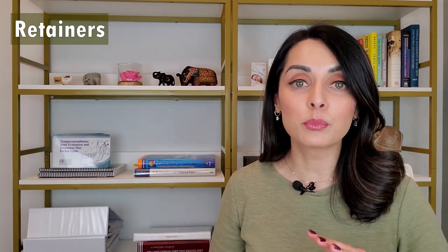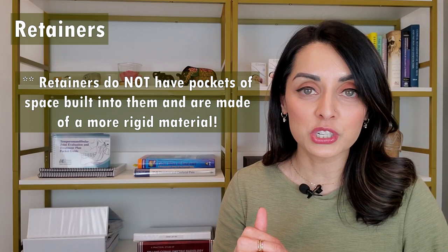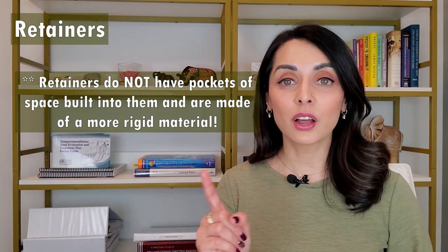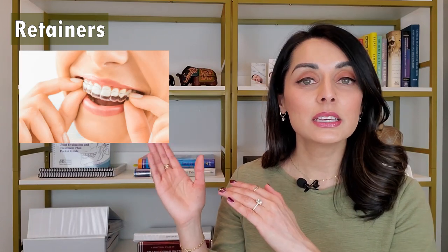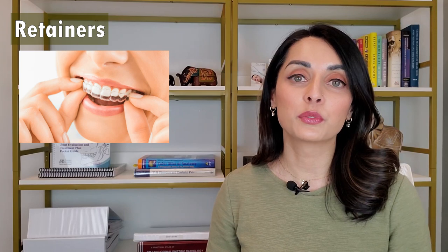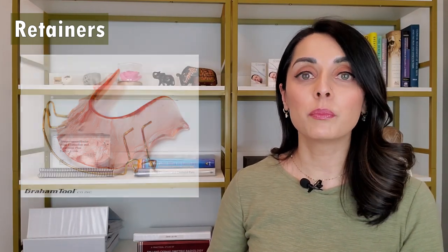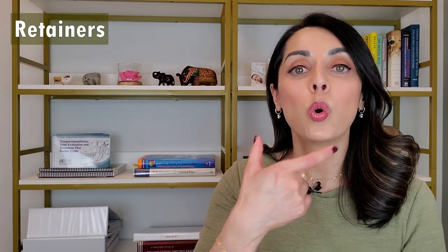How are retainers different from bleaching trays? They are quite different. They might look similar because some retainers can be clear and look like a bleaching tray, but they are quite different. They still fit well over the teeth, but there's no pockets of space to allow for whitening agent, and they fit pretty rigidly against the teeth. The primary function of a retainer is to hold the teeth in place — not to allow room for whitening agent like a bleaching tray. If the retainer is in fact clear, it often looks like this — this is an Essex retainer. Another popular type is called the Hawley retainer, and it has pink acrylic and metal wires to hold the teeth in place. Even though retainers are made from impressions or scans of the teeth and kind of look like bleaching trays, they are made of a more rigid material and fit very precisely to the teeth, holding them in place.